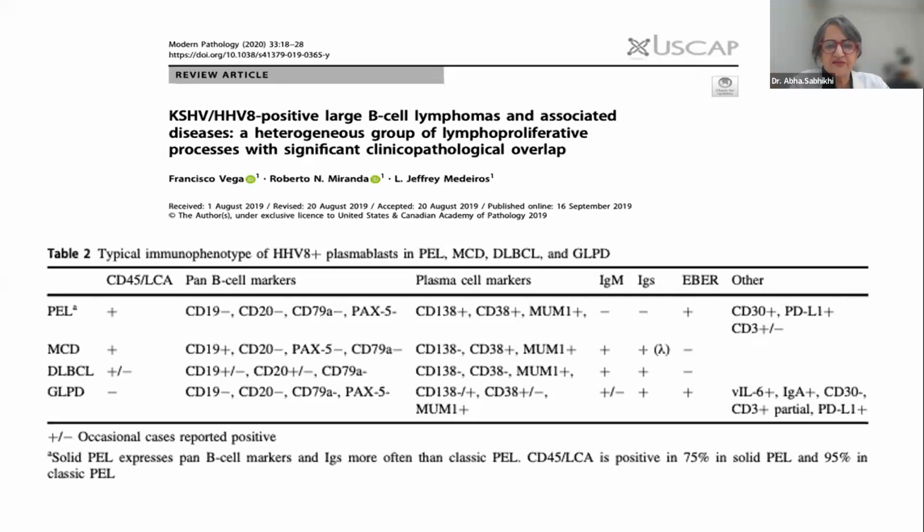Very interesting case. Very interesting case. Someone has asked the significance of rosettes. First slide.